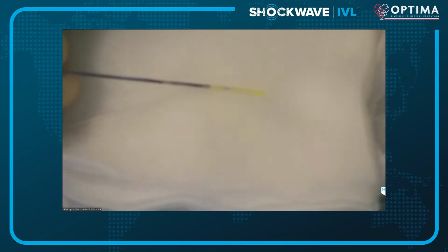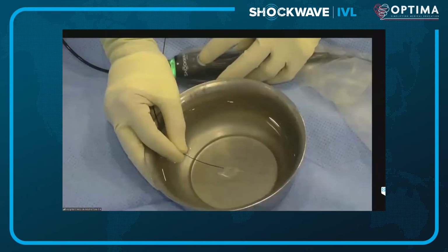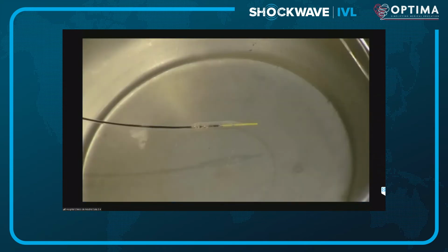You know how this works, of course, but for colleagues that have never seen how this works, let me just refresh this with a small video that we are going to show you, basically showing what happens when you deliver energy. And you can see these sparks that are generating compressive and decompressive forces.